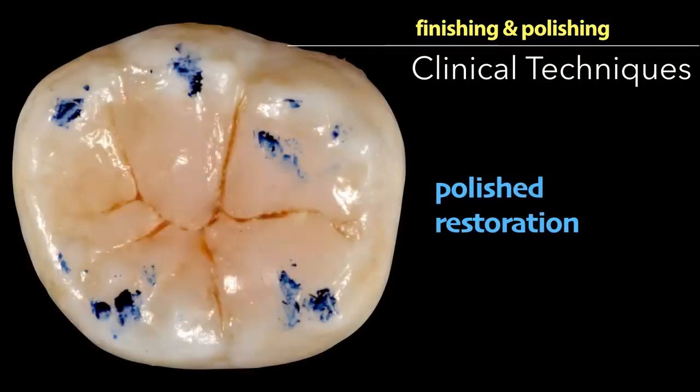Then after completing all the procedures, you can first of all visualize the occlusal contacts. We recorded the occlusal contacts in the previous initial picture, so you can see the same occlusal contacts in the final picture. It means we know how to record the previous contacts and follow them in the post-op picture. That is only possible if you have a documented record, and that is with photographs. So take photographs and follow these photographic marks in the final adjustment of the occlusion.